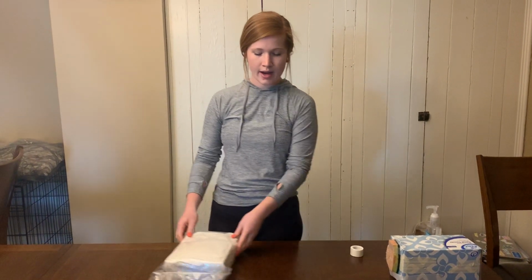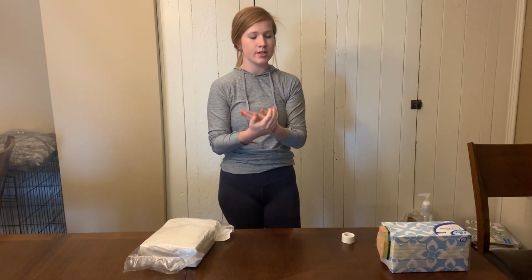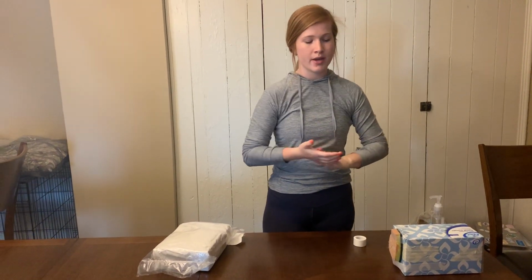Okay, so to begin, I would enter the room and start by performing hand hygiene. And I would introduce myself to the patient, just say, hi, I'm Emily, I'm going to be your student nurse today. And then I would verify their name and date of birth based off the records that I have and their wristband, also verify any allergies.